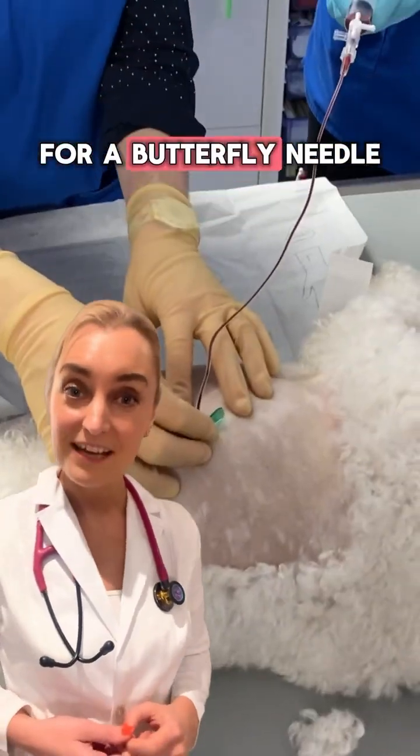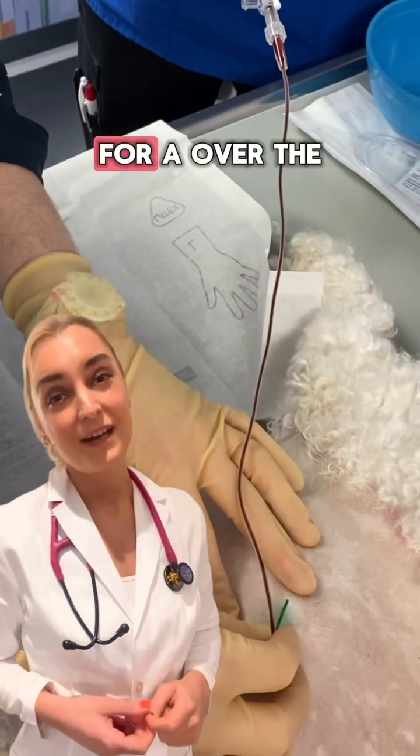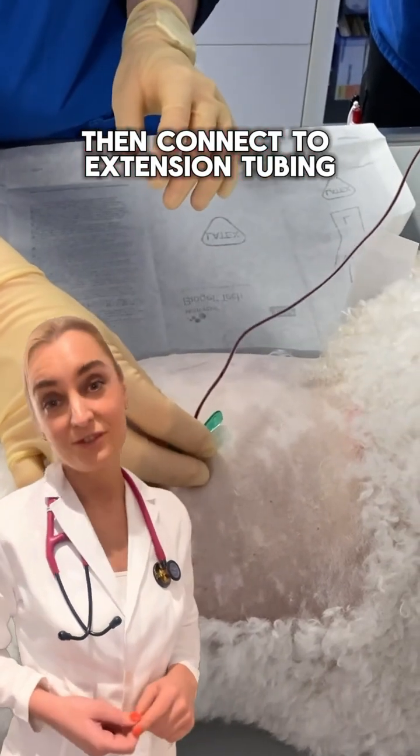For a butterfly needle, connect it to a three-way stopcock and syringe. For an over-the-needle catheter, advance the catheter while retracting the stylus slightly, then connect to extension tubing.